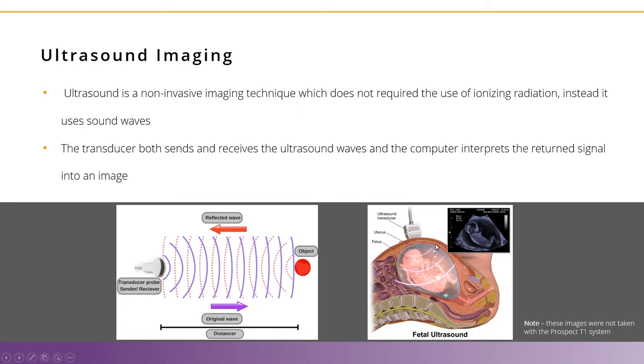And the probe is simply moved over top of the skin to look and identify for the different anatomical targets. The same applies to the preclinical world. The hair is removed from the animal, the probe is placed on the skin in contact with the ultrasound gel to allow the sound waves to be transmitted, and we get an image of the anatomy below.